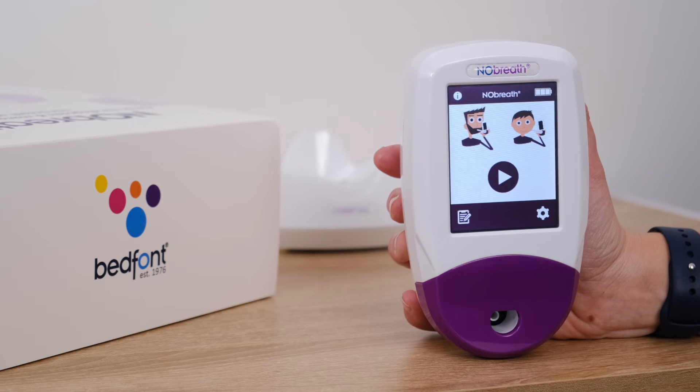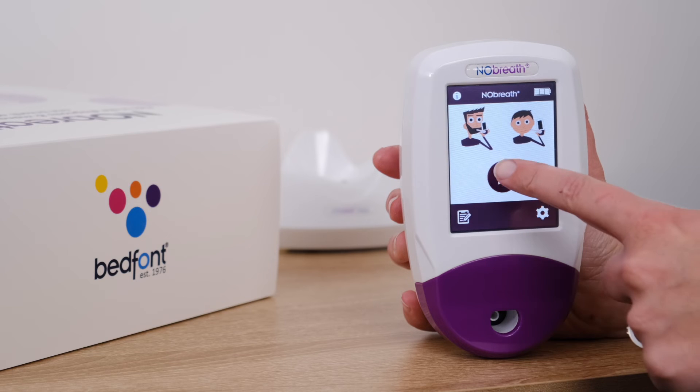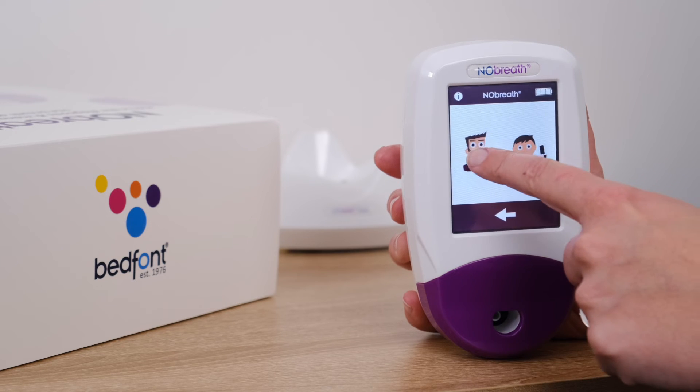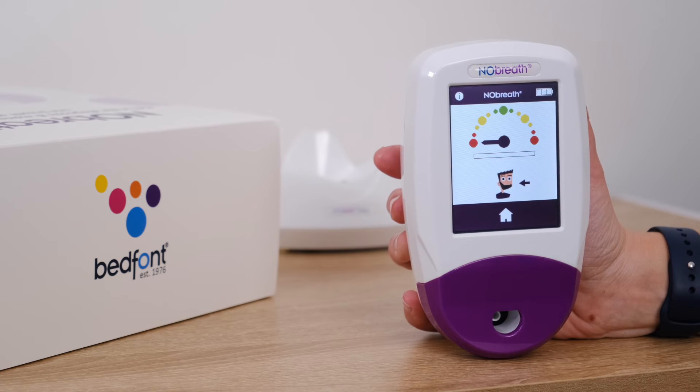The demonstration mode is a helpful video guide which shows a patient how to follow the on-screen motivational guide when taking a Pheno breath test. To watch the demonstration video, press the play icon. Select either the adult or child breath test icon and a demonstration will begin at an accelerated speed. Press the home icon at any time to exit the demonstration mode.